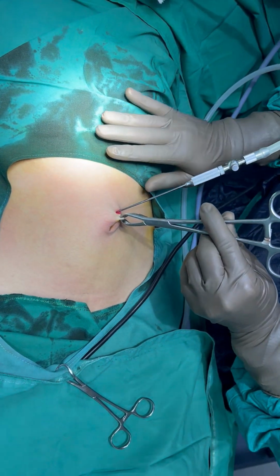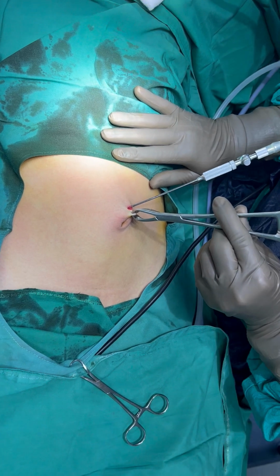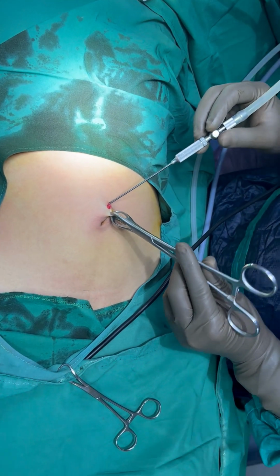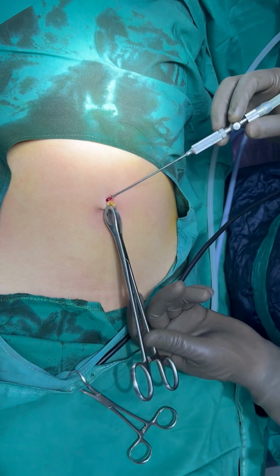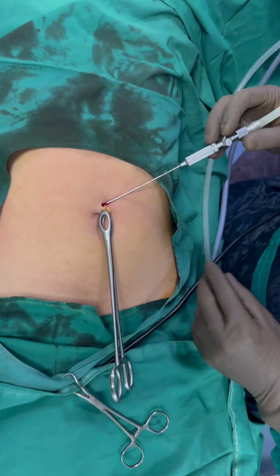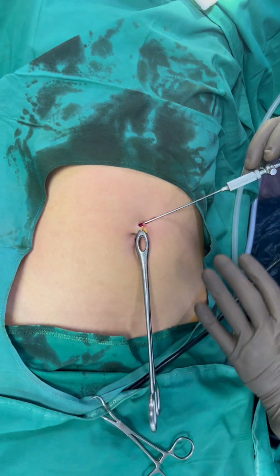While starting the CO2 inflation, we have to check there is an equal distension of the peritoneal cavity in all quadrants of the abdomen. See, abdominal cavity is distending equally in all the quadrants.